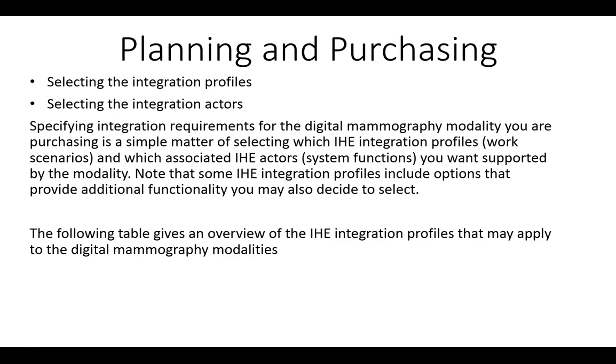Planning and purchasing. Selecting the integration profiles and actors, specifying the integration requirements for the digital mammography modality you are purchasing is a simple matter of selecting the IHE integration profiles, basically work scenarios, and which associated IHE actors, system functions, you want supported by the modality. Note that some IHE integration profiles include options that provide additional functionality you may also decide to select. The following table gives you an overview of the IHE integration profiles that may apply to the digital mammo modality.